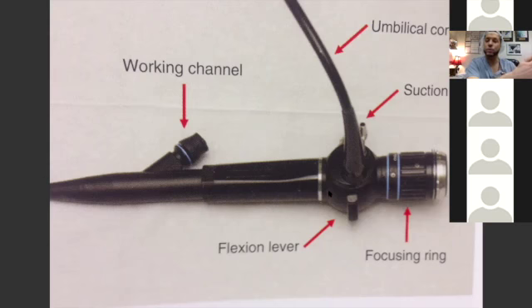Also, look at the video screen. Make sure on the video screen that up is up. I did a double lumen yesterday, and the camera head was clearly upside down because when I went in, right looked left, left looked right, but I saw the tracheal rings on the bottom, so I knew that the membranous side up top was actually the bottom. So I rotated the camera, had the membranous side, the tracheal rings, and now right was right and left was left, and I was down the left, and everything was good. By the way, I did an erector spinae block on that open thoracotomy and zero pain. Very effective.